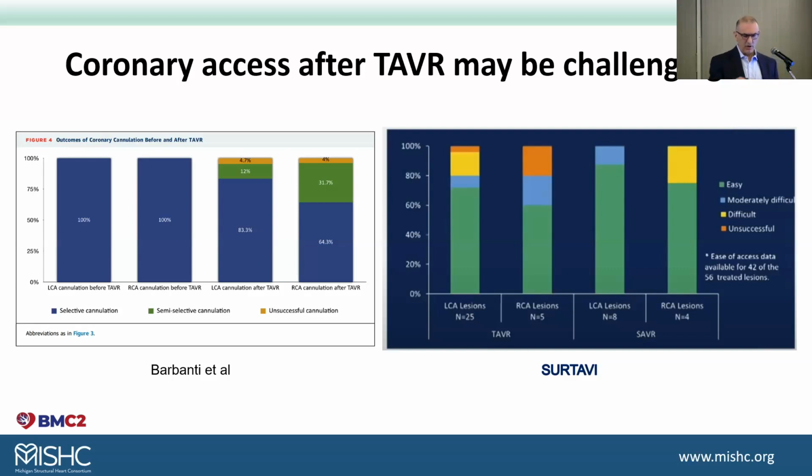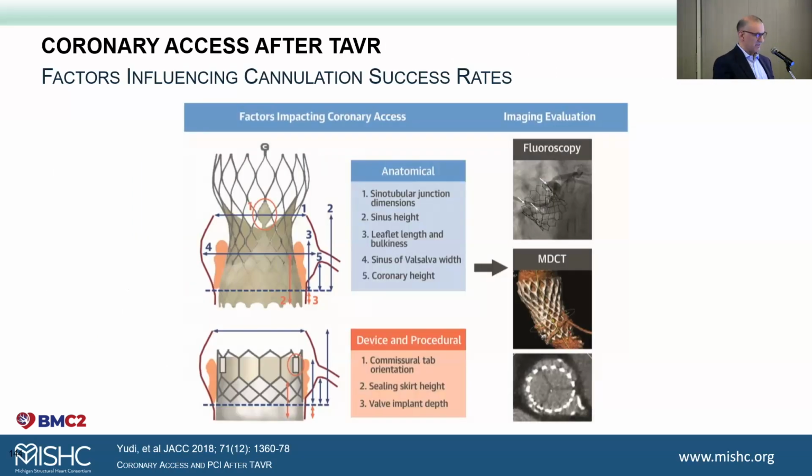And I've put the onus on us interventionists who do TAVR, excuse me, I keep going to the European word, and on industry, who has siloed the structural specialty into a structural field team that has not really shared techniques and best practices to the population at large. So for those of us who live in this space, this comes natural. I know what the issues are with coronary access with a CoreValve.